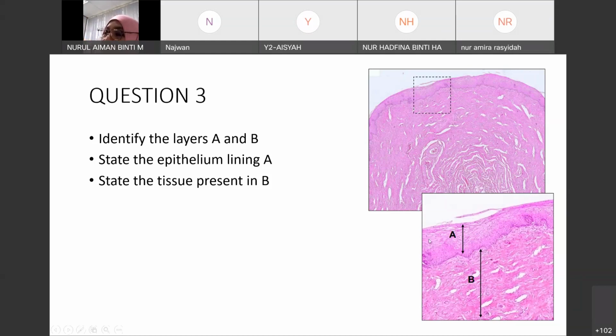This is vagina. Let's say I give you one question, and then suddenly you find this one. Don't answer skin or the mucosal surface inside your mouth. Say this is the vagina. Don't answer as mouth.